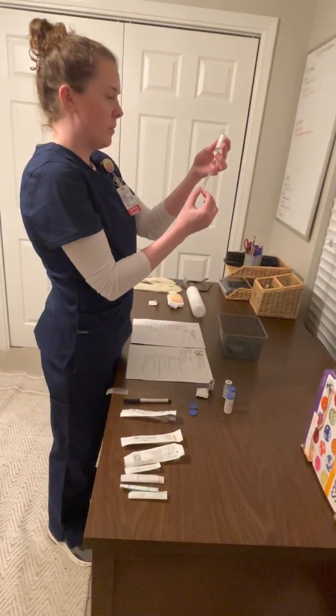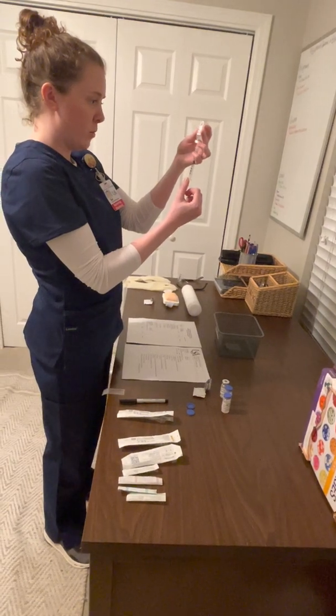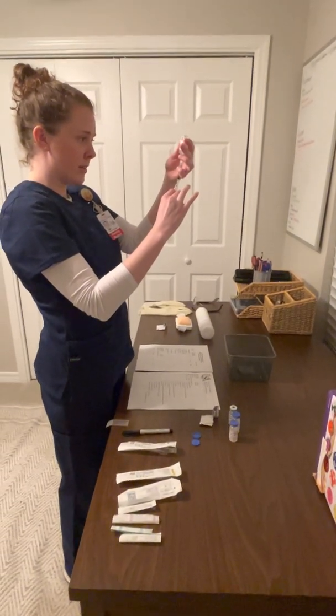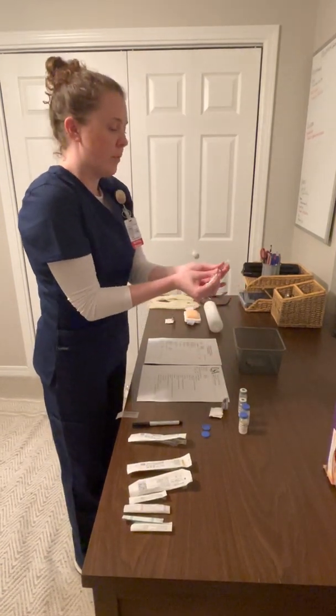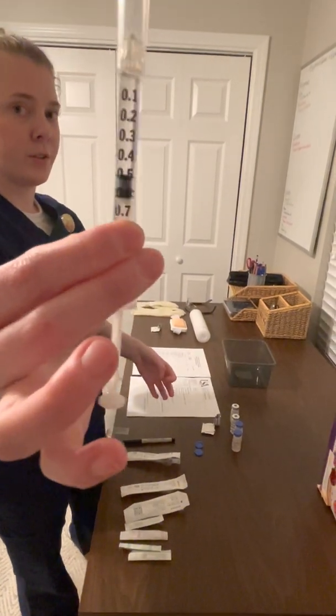Then I would pull 0.5 milliliters of heparin. I will pull more than 0.5 milliliters just to expel any air bubbles that I have, and then I will correct the dose back to 0.5 milliliters. I'll pull up on the safety and show you that I have 0.5 milliliters of heparin.